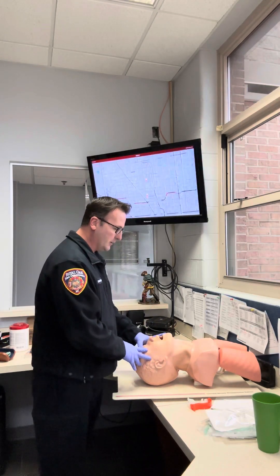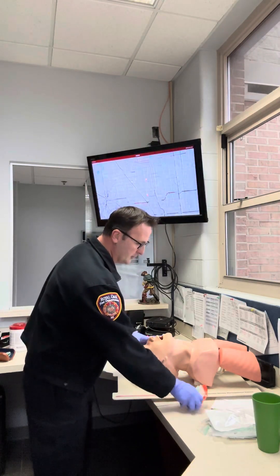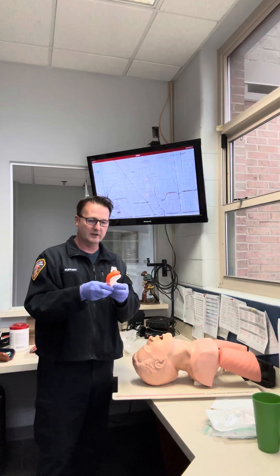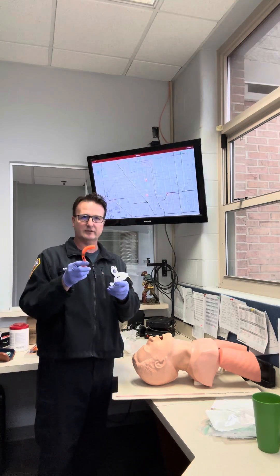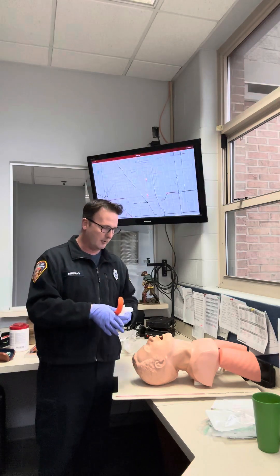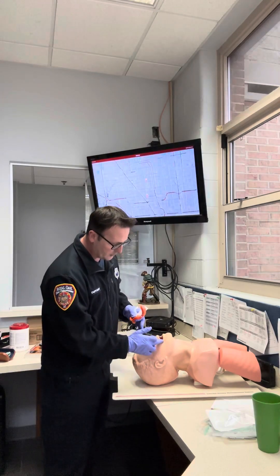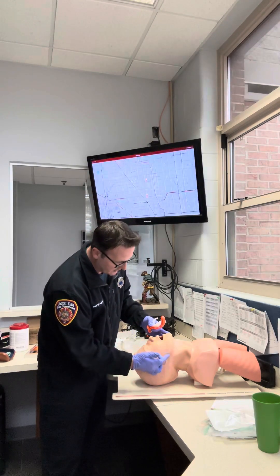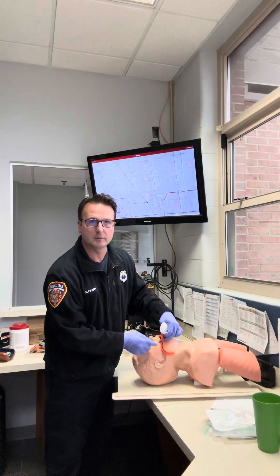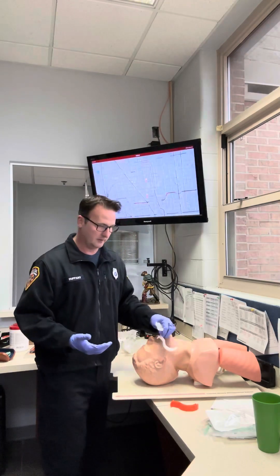After that, you want to go select an airway adjunct. I brought numerous examples of the different types of airways that we carry on our rigs — from 30s, 40s, or 4, 5, 6, all the way up to 100s. What you're going to do is measure for the oral airway from the corner of the mouth to the angle of the jaw. So you measure like that — that one's too big, and then that one fits perfect.